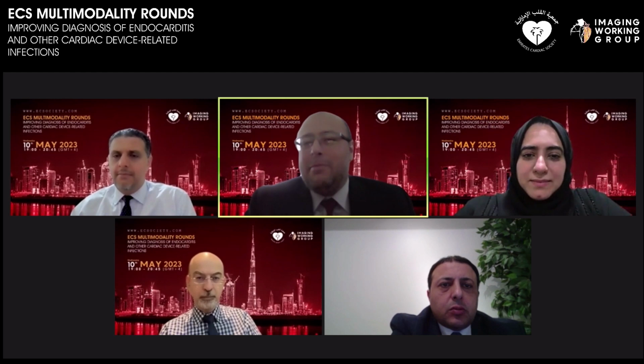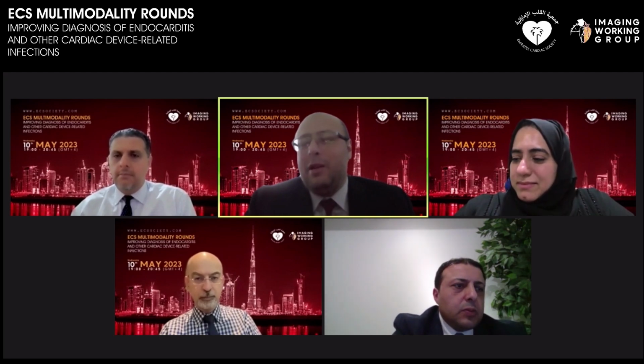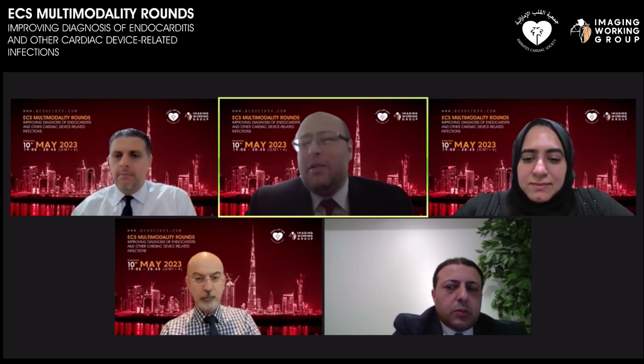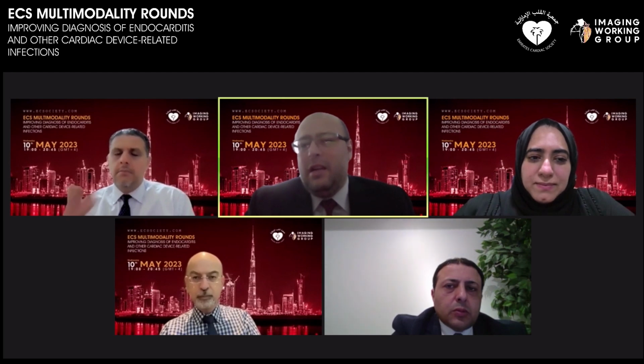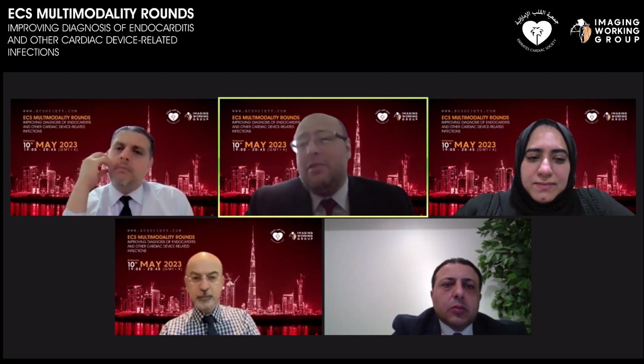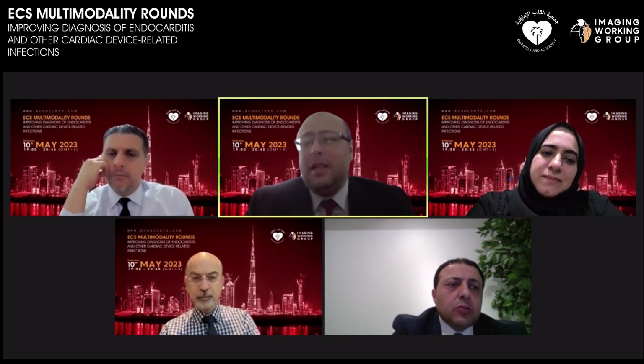And even if there is uptake, you just saw this case, there is uptake, but it's not enough. If it's only at the rim where the myocardium is touching the LVAD, that's fine. But usually the amount of infection in these cases is way, way more, and the bulk of them that I've seen are in the drive line and in the outflow track. The drive line or outflow track are a little bit far from the myocardium. You also get a lot for EVAR, TEVAR, dialysis fistulas, abdominal aortic aneurysm, all these devices that we get for these.